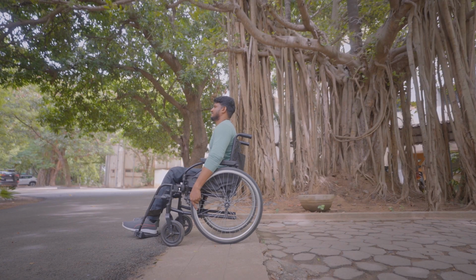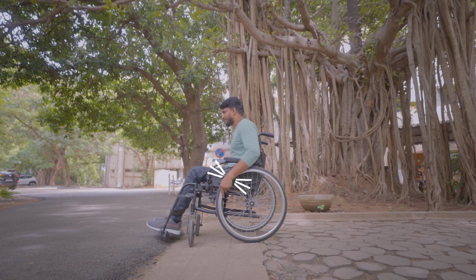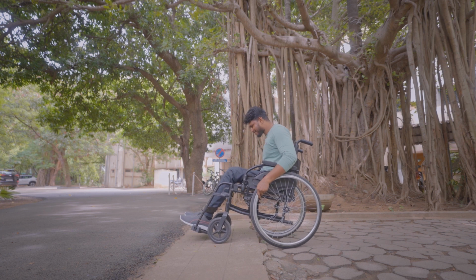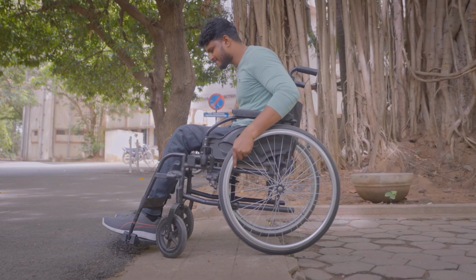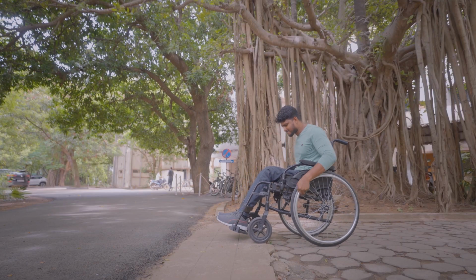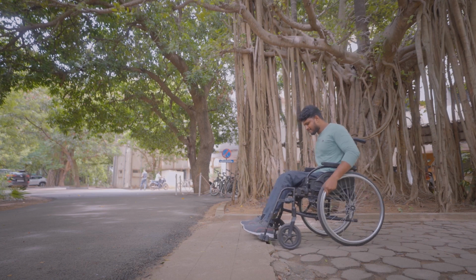Moving backward independently down a small kerb. Begin with your back facing the kerb and bend your upper body forward. Hold the push rims at knee level and pull the wheels back slowly. Keep looking over both your shoulders as you lower both the rear wheels down the edge of the kerb. Apply adequate pressure on the push rim to prevent a hard landing or a fall backward. Keep pulling the rear wheels back slowly until the casters clear the edge of the kerb.